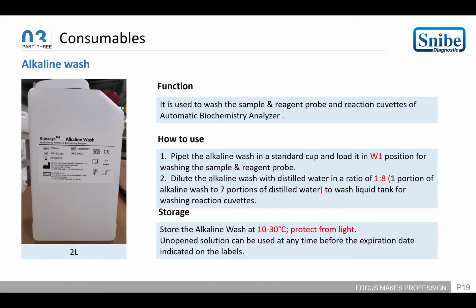Another function, you use it as the wash liquid. So you have to dilute the alkali wash with distilled water in a ratio of 1:8. For these consumables, we have to keep them at 10 to 30 degrees and protect from light. This is about the alkali wash.